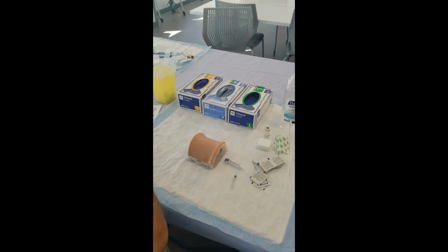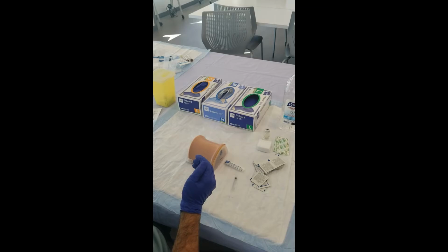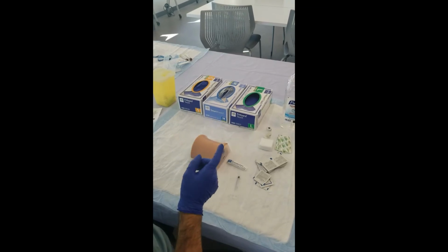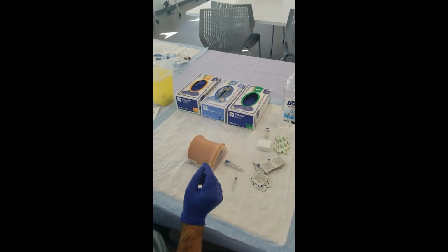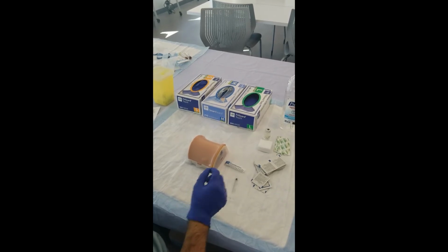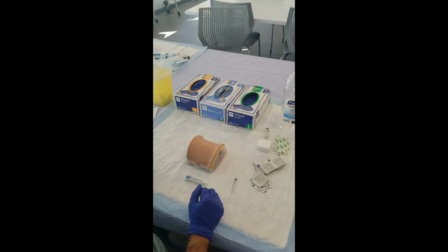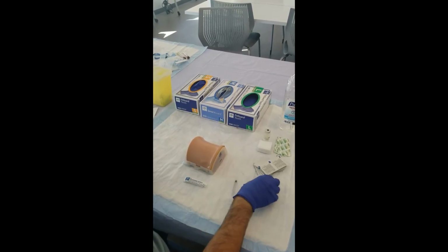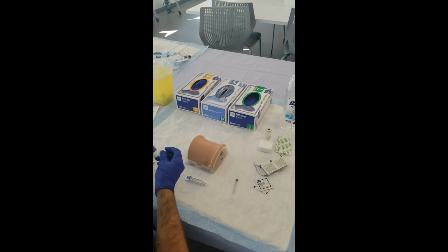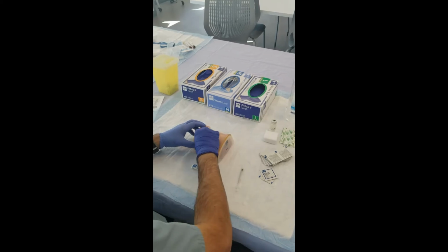Step 34. Stated needle length and gauge ranges for intramuscular injections. The needle needs to be 1 inch or larger in length and at least 20 gauge. Note, a 22 gauge needle may be used for testing to preserve the life of the task trainer. Items 35 through 36 can be done in any order. Step 35. Found and cleaned an appropriate injection site with 1 alcohol wipe in a concentric circular motion moving outwards. Allowed alcohol to dry.